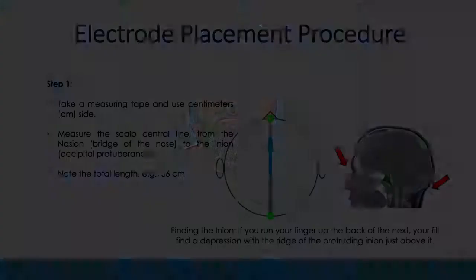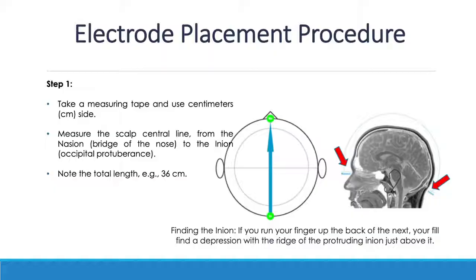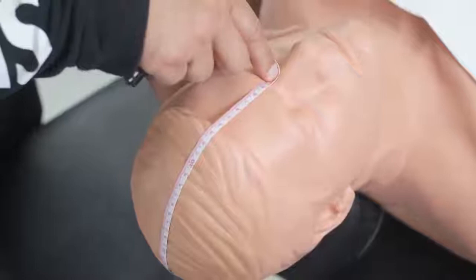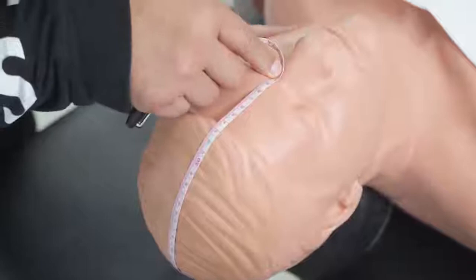The first step is to measure from nasion to inion. Place the measuring tape at the nasion and measure the distance from nasion to inion. This must be in centimeters, not inches. If the distance is 40 centimeters, the 50% point is the CZ point, which is 20 centimeters. However, that CZ can be tilted toward the left or right side depending on how you are placing your tape.